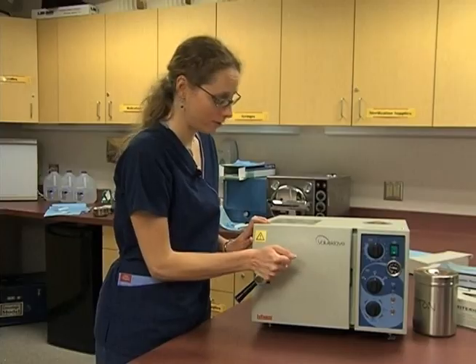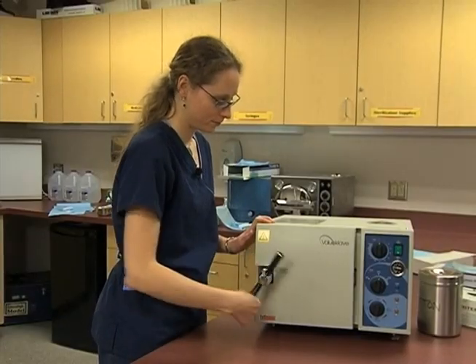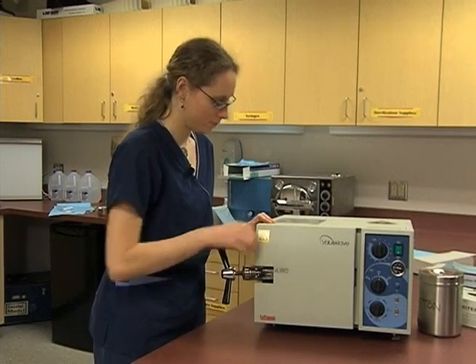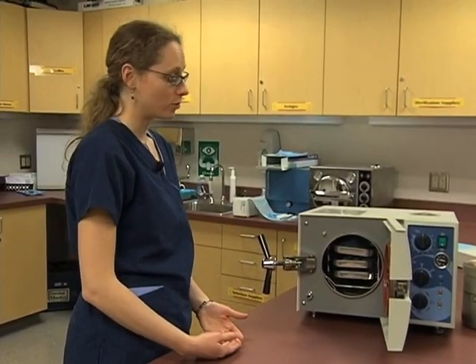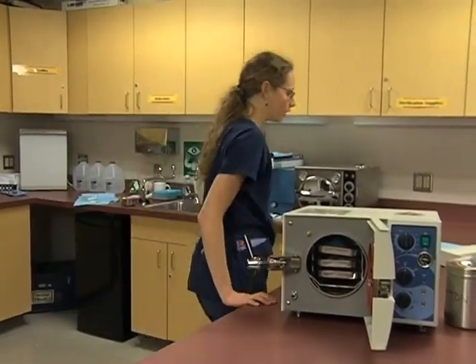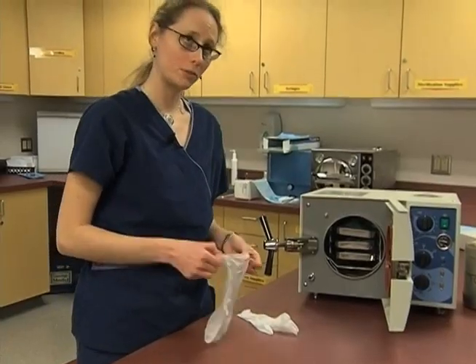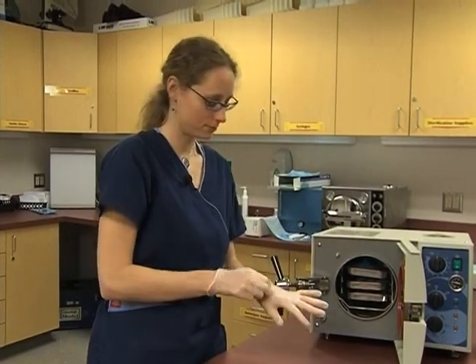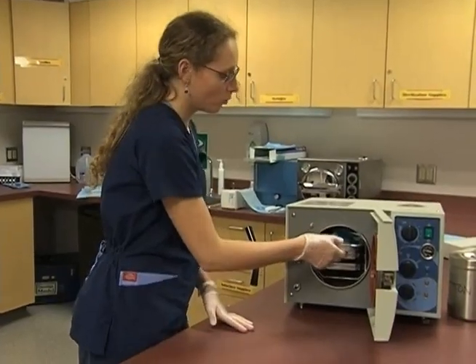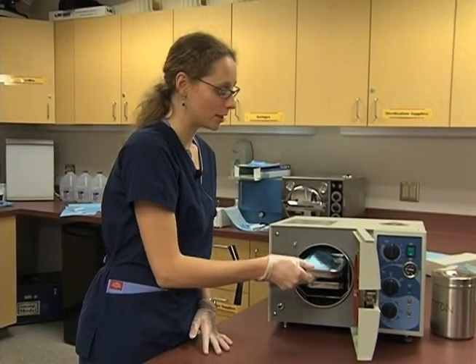All the items should be dry when we pull them out. Some offices have different procedures for putting items away — our office has us wear gloves when we handle things that have been sterilized and put away. This is especially important if you have any breaks or sores on your skin or dry skin, as a lot of procedures have to be done with gloves on to protect our patients. When we remove items, they should be cool to the touch — sometimes after the cycle they can be quite hot and need time to cool.